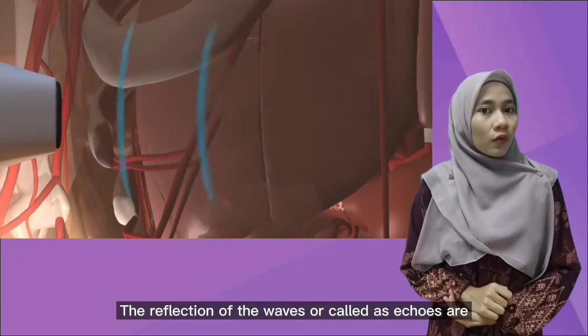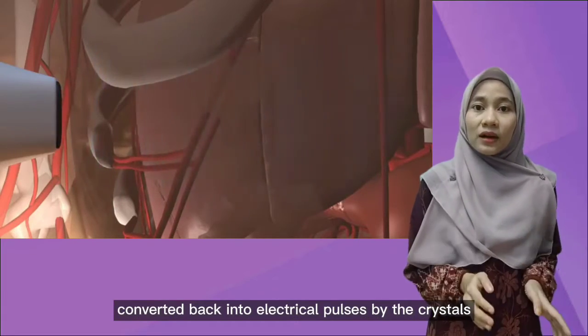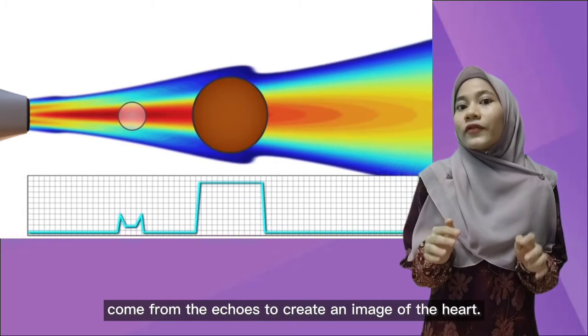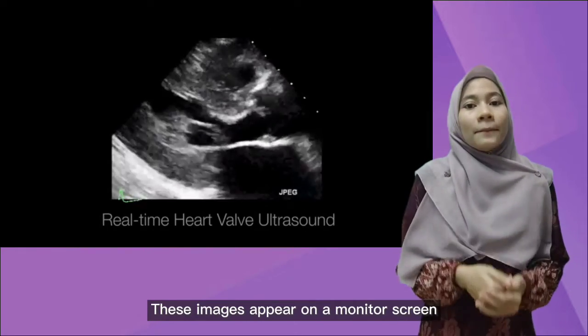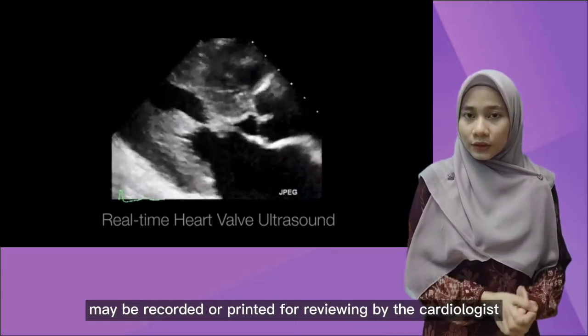The reflections of waves, called echoes, are converted back into electrical pulses by the crystals. Then a computer assembles the electrical pulses that come from the echoes to create an image of the heart. This image appears on monitor screens, and may be recorded or printed for review by the cardiologist.